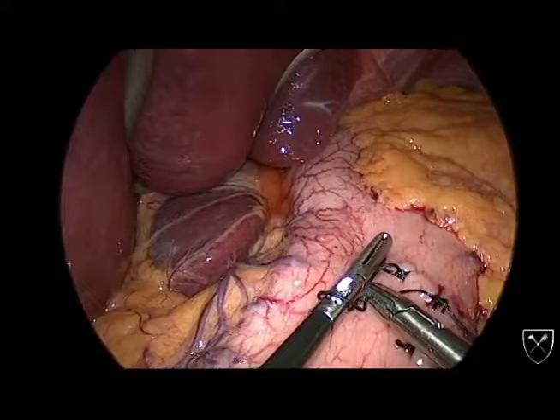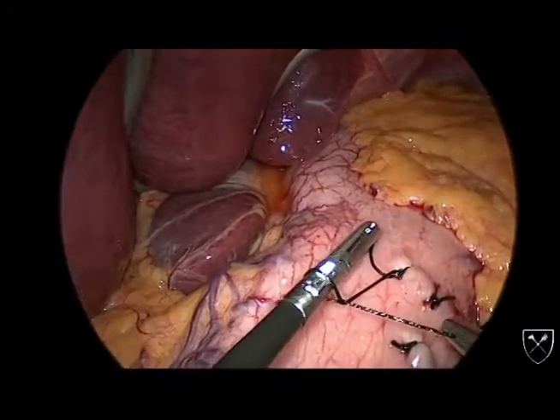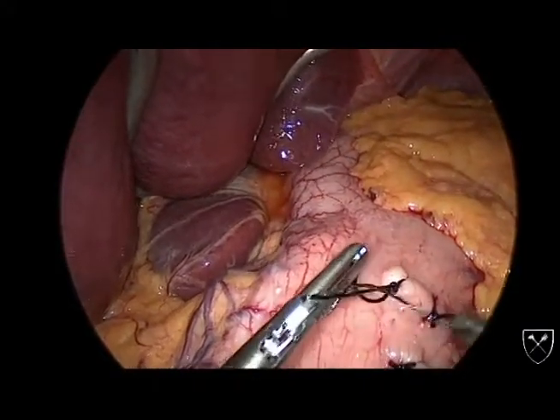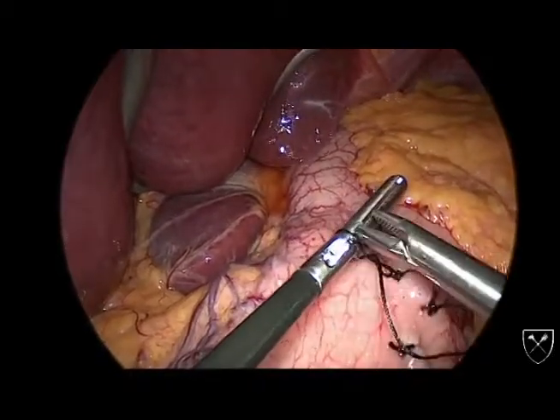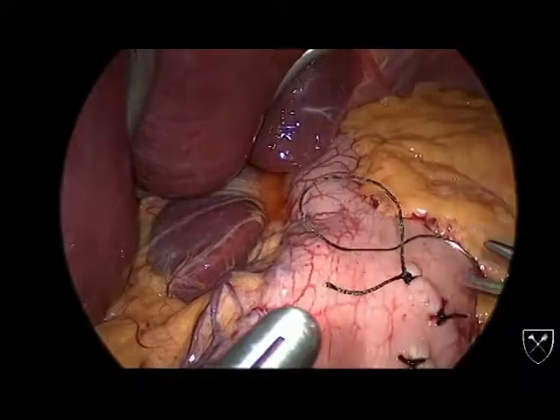Another pitfall is if the tips of both instruments wander away from each other. Your loop will end up so tight that you can't move, or the loop will get caught in the gears of the grasper. Again, you encounter these problems more when your sutures are short.